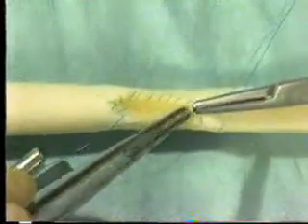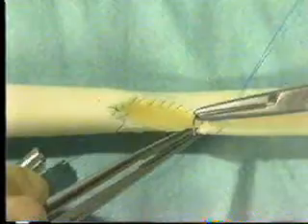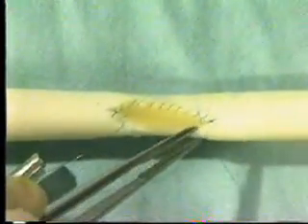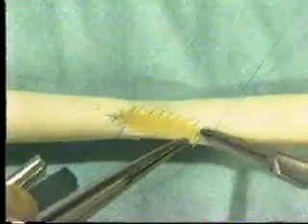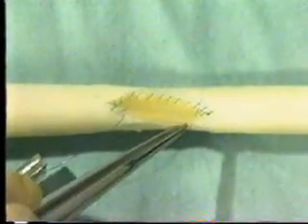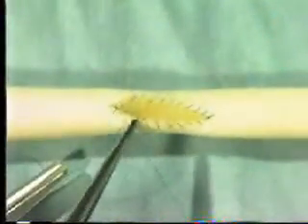Now take the other end of the original suture and start to suture down the proximal wall, again going from outside to inside on the vein patch and inside to outside on the arterial wall. Take care not to handle the suture material or the arterial wall with your forceps. Continue down the proximal wall until the initial suture is reached, then ligate the two sutures together.